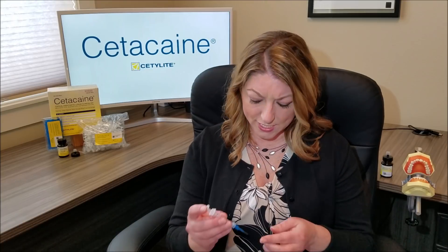You can see the liquid stays fluid to spread and absorb into the pocket. One half syringe is enough to treat one to two quadrants, so you can see how just a little bit goes a long way. It also isn't harsh or bitter tasting — to me, it kind of tastes like a sweet banana, but definitely not bitter.